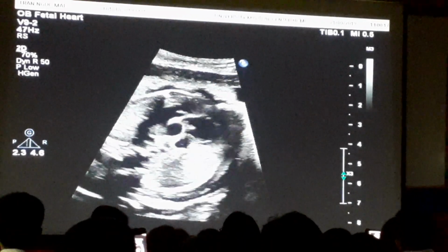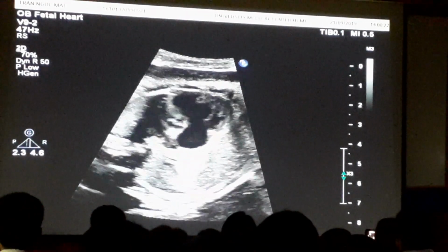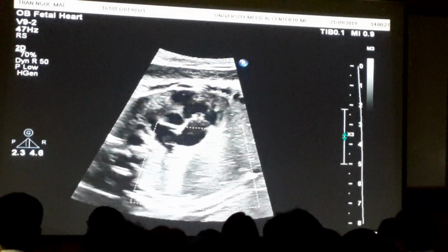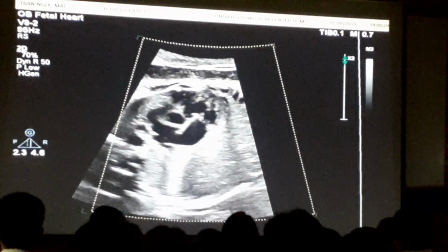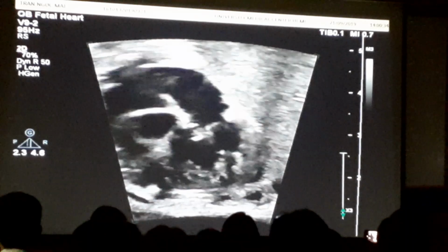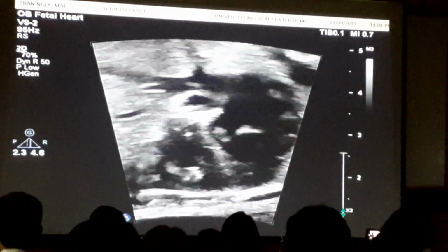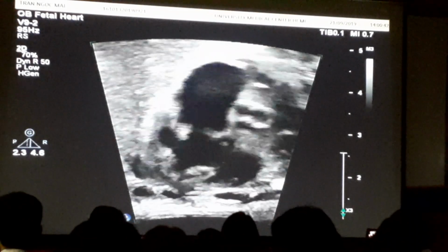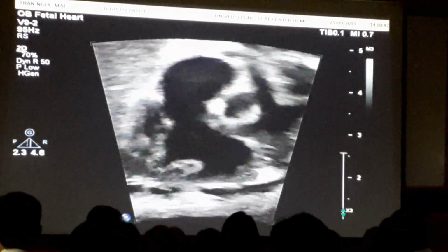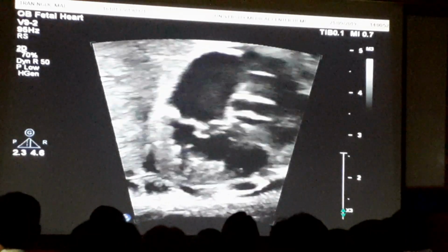Và như vậy là cái đến giờ thì chúng ta thấy là tất cả những cái khảo sát thì cái cấu trúc là không có bất thường, chỉ trừ cái van ba lá nó có cái bất thường một chút, và đặc biệt là cái thất phải nó phì đại nhưng mà chức năng co bóp tốt, nó có hở van ba lá, và với cái áp lực nó tăng cao như vậy thì có thể là đây là cái bệnh lý của cái truyền máu song thai mà bắt đầu nó trên đường nó hồi phục. This baby has a good cardiovascular profile score of about 8. Cái chỉ số cái điểm tim mạch của bé này là khoảng 8.